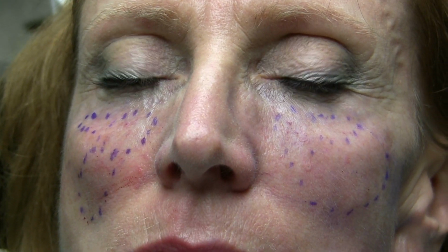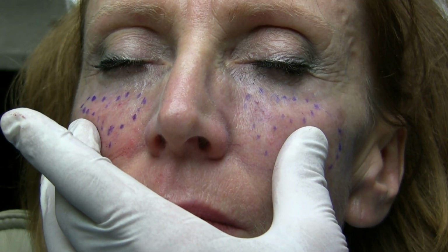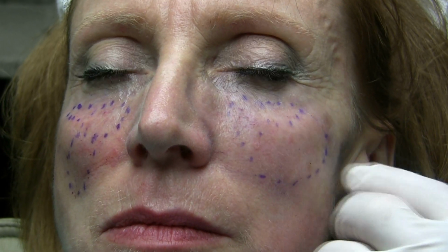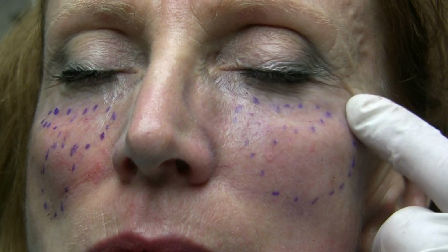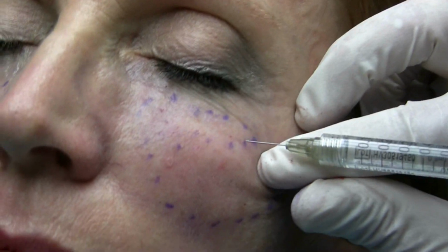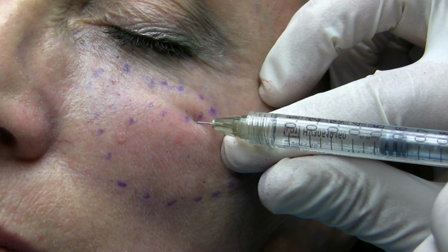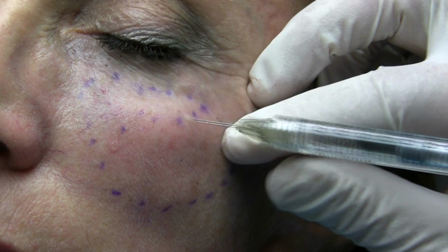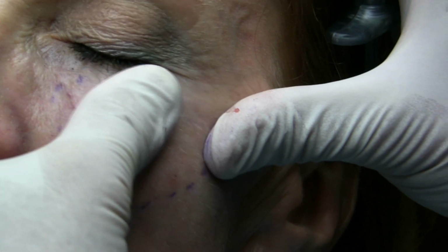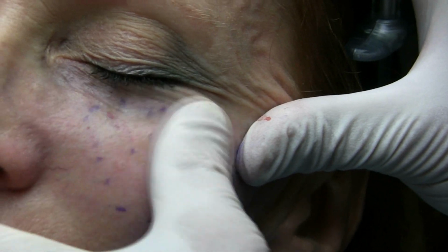I could treat this patient with some customized implants, some off-the-shelf cheek implants, and a little facelift, but for a fraction of that price, she's going to get a nice correction here for a while. So it's a great little procedure, and fillers have really changed cosmetic surgery in the last decade.